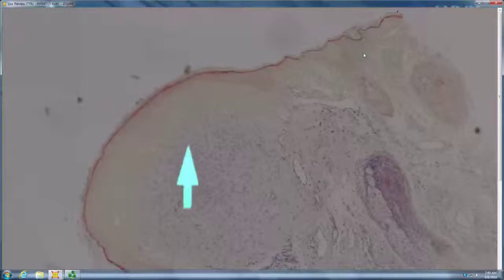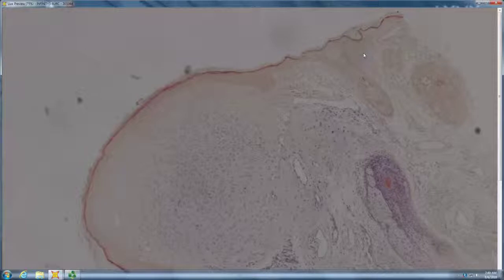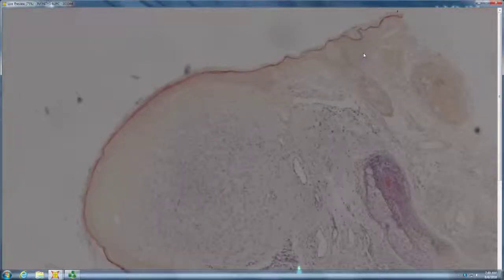a ball-like collection. It looks like the world's largest papillary mesenchymal body sitting there just by itself. That's what's been called a trichodiscoma. So trichodiscoma is just the stromal. Oh, it's like a fibrofolliculoma without the. It's the fibrofolliculoma caught in a planar section where you don't see all the strands. Absolutely correct. Well done.